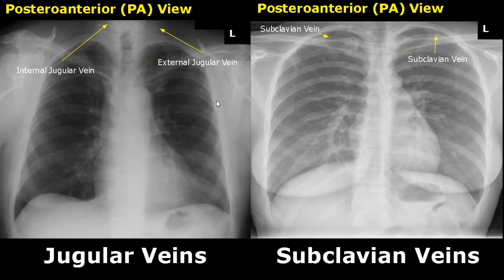These are the locations of the jugular veins. The internal jugular vein will be deeper in the neck and the external jugular vein will be superficial.